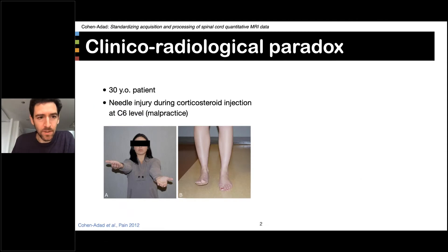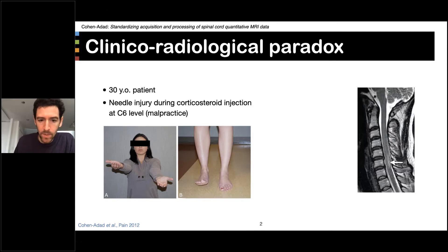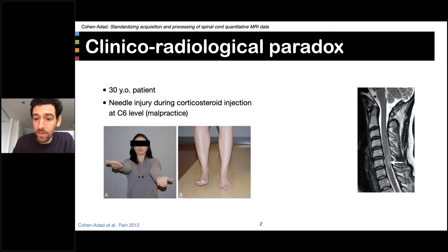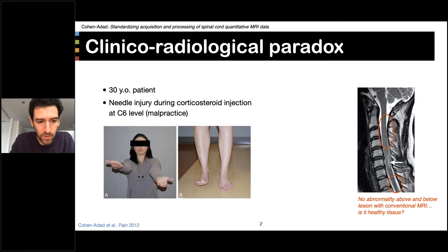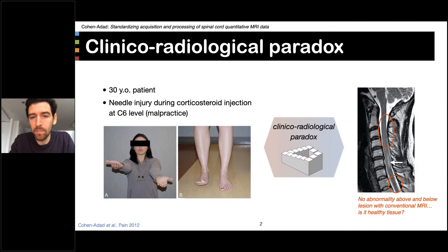You now see the slide of the patient who has suffered from sensory and motor deficits due to this needle injury. We can see on the local T2 image a hypersignal at the level C6. However, there is no visible abnormality above and below the lesion, which is somewhat in contradiction with the clinical evaluation of the patient. And this contradiction falls into what we call the clinical radiological paradox.